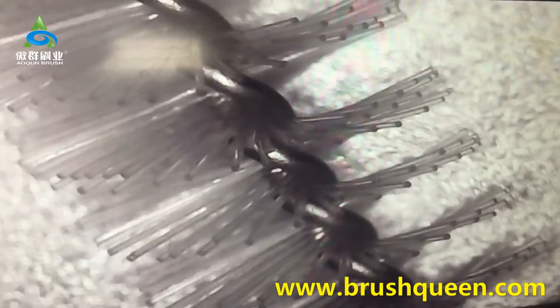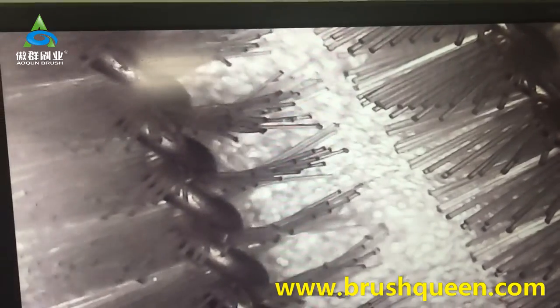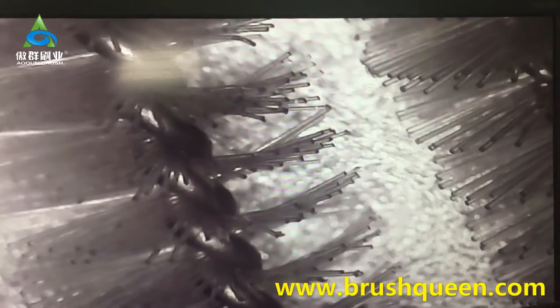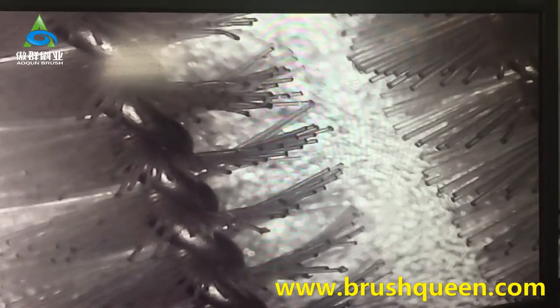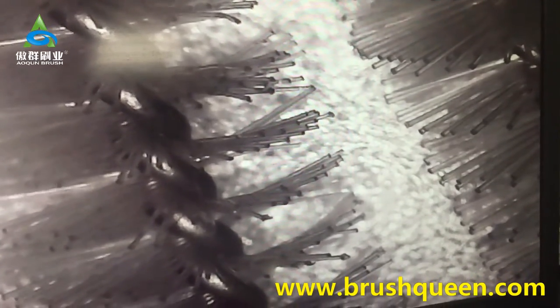Now we can compare the two brushes. On the right is the Outrin Brush. You can see the competitor brush has a burr and a slit on the left, but the Outrin Brush has no burr and it is tidy.